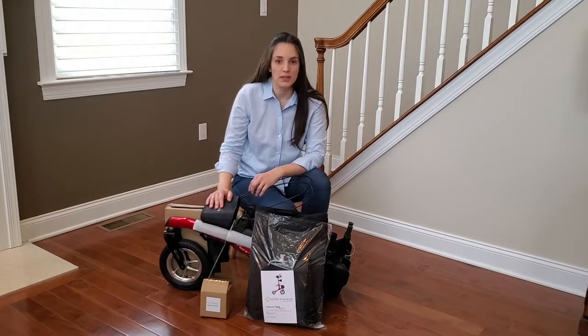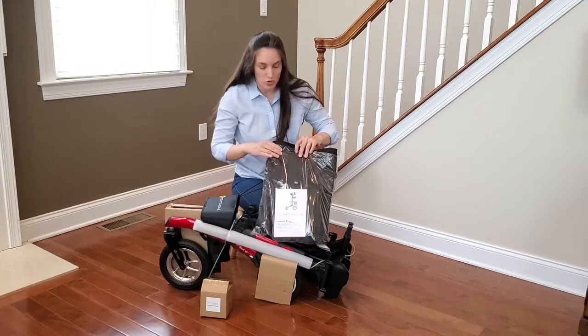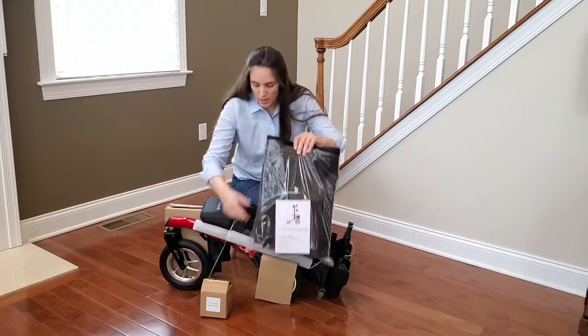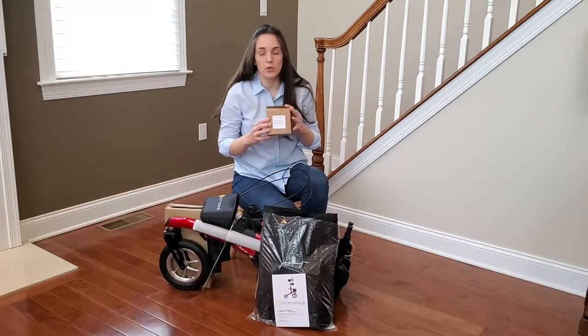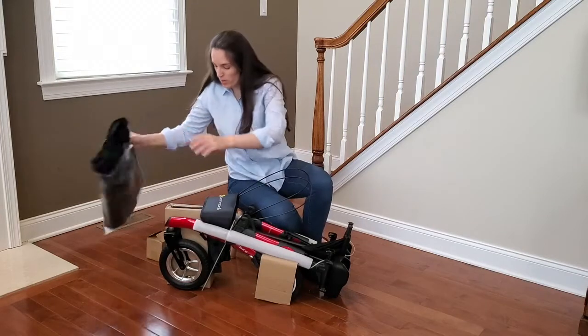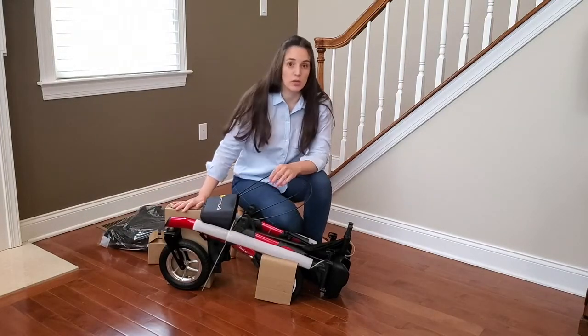These are the components you're going to find inside the box. You'll find this bag with the travel bag, the shopping bag, and the user guide. And you're going to find a little box with the cane holder, the cup holder, and a couple of other pieces we're going to use throughout the assembly process. In addition to that, you're going to find the walker with several protective materials that we're going to remove.